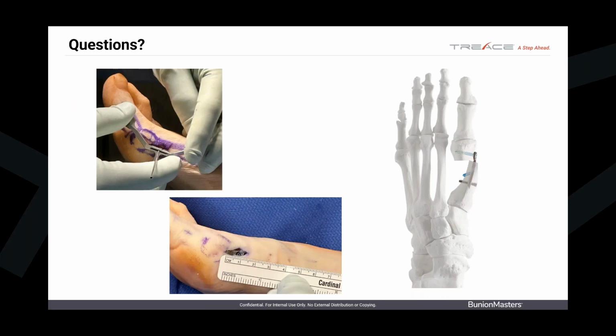So unlike other procedures, when you do the lateral release at the beginning in order to allow your head to rotate or position, we don't need to do that. We're moving everything in that joint as a function of one. So if we're going to do a lateral release, it's only going to be done if there's a small amount of snapback of the toe against the second toe, if the toe is not sitting straight and off the second toe when you've done your Akin and when you've done your osteotomy and secured your medial head. And the only time you want to do it is then.